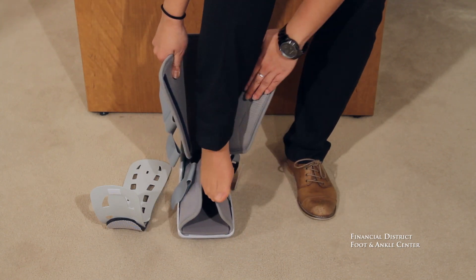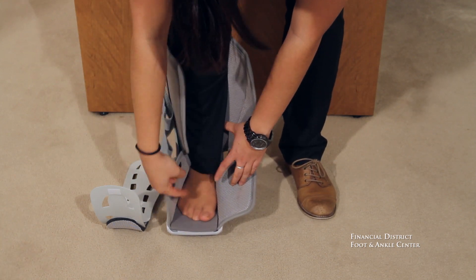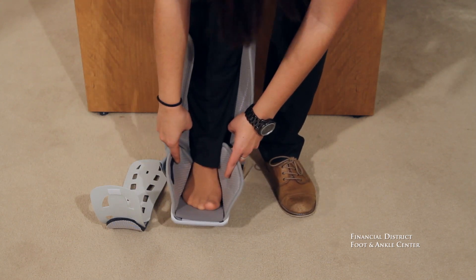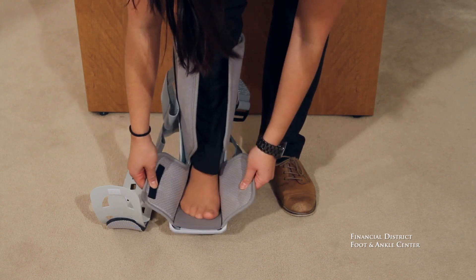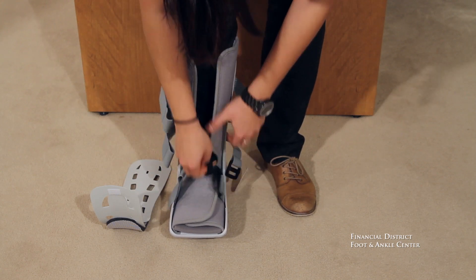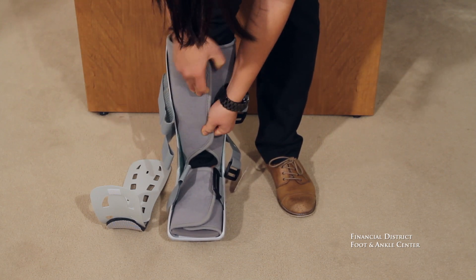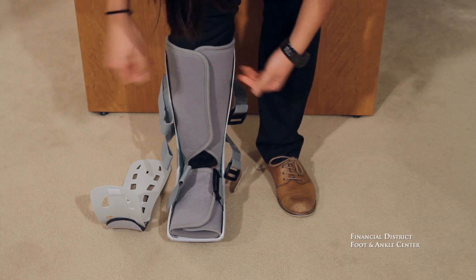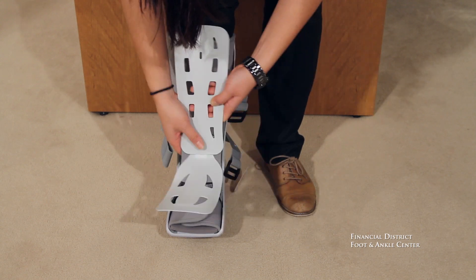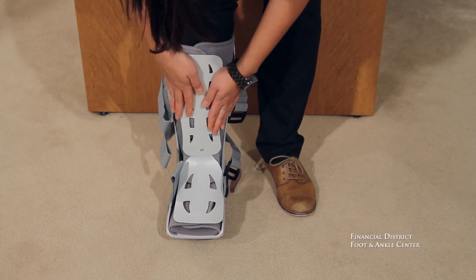We'll use those air bladders later to better conform to your ankle. So then we're going to stick our foot into the air cast. You want to make sure that your heel is all the way back into the boot — you can wiggle it in there. Then we're going to fold the top and velcro it over, same up here on your shin. Then we take the front cover; the shorter piece goes across the toes and velcros right to the front.